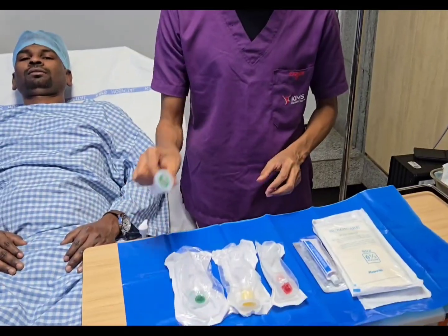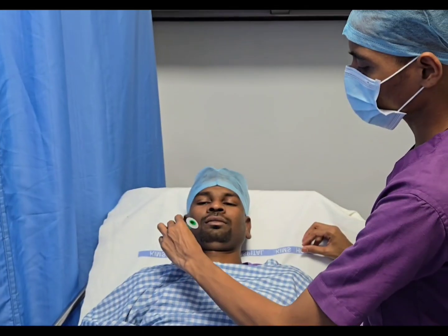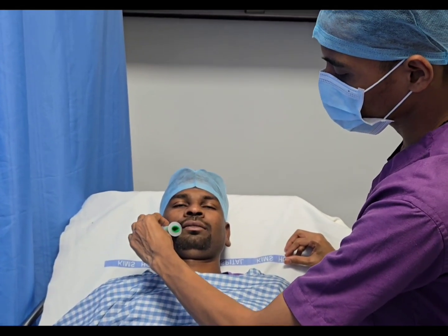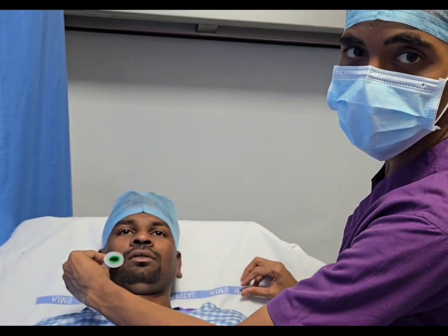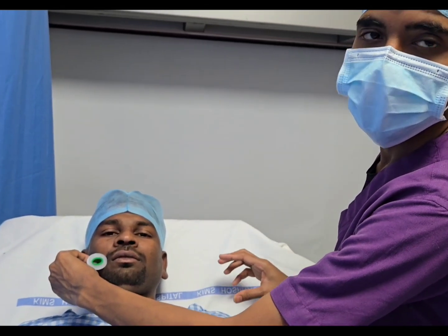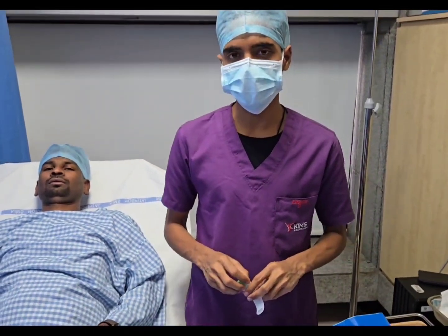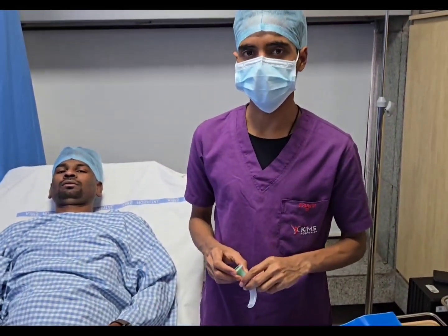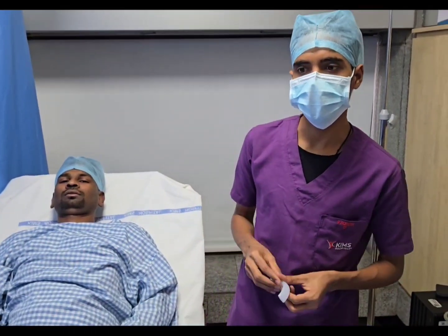How will we measure the oropharyngeal airway? We measure from the corner of the mouth to the angle of the jaw. This is the way we measure the OPA. There are three sizes: 2, 3 and 4. According to the patient's size, we select the size and keep the oropharyngeal airway.